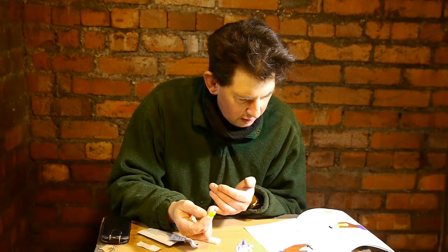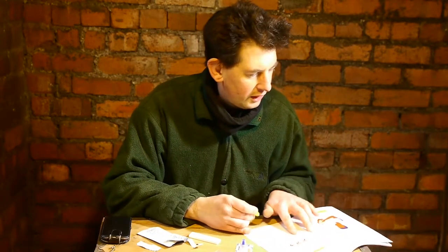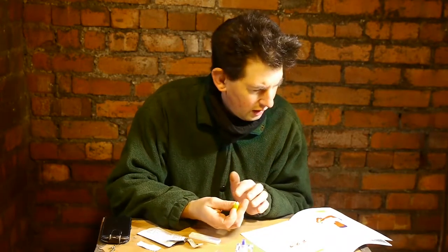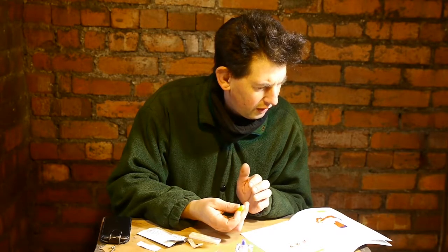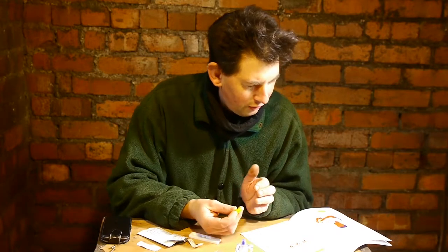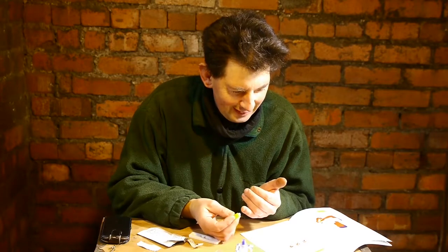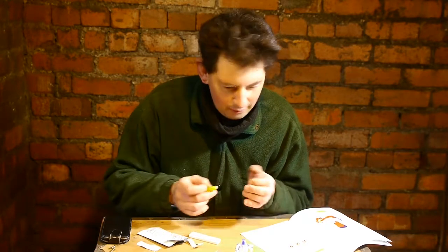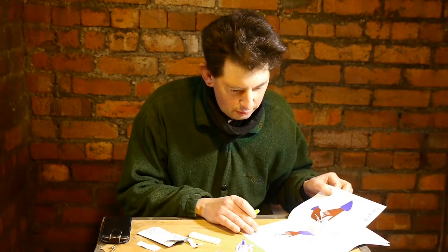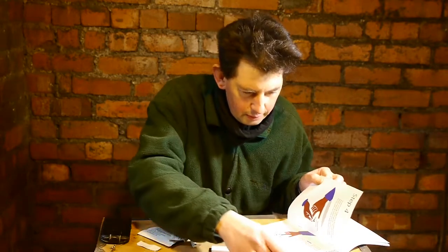Okay, choose a spot, wipe it with alcohol, done that. To draw blood, press the uncapped end, that's this end, against the finger, and press until you feel a click. I don't want to do this. Do not tamper with the light. Okay, just got to see what I'm going to do next. Squeeze blood from the finger, put it on this thing. Okay, yeah, let's do it then.